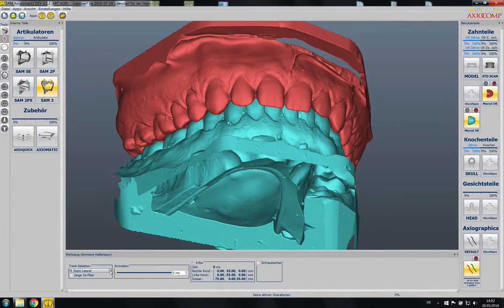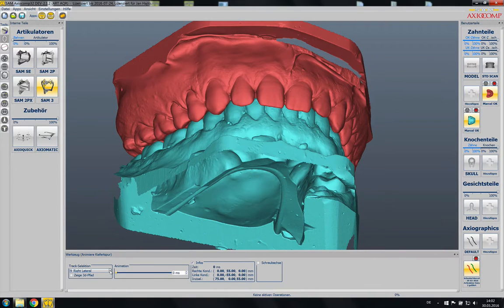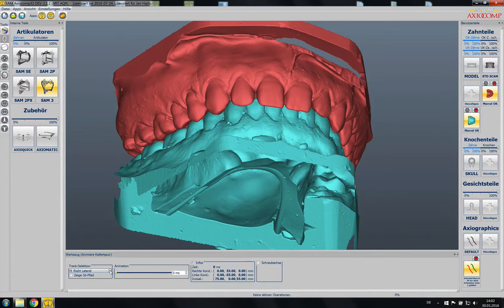Here I show you an example of a patient case where I imported the scans in Axiocomp. The casts were mounted in an articulator with a face bow and then scanned as they were mounted, so they are correctly positioned in regard to the skull.